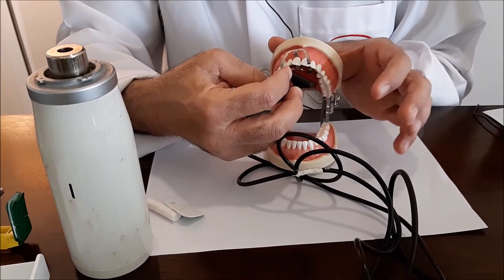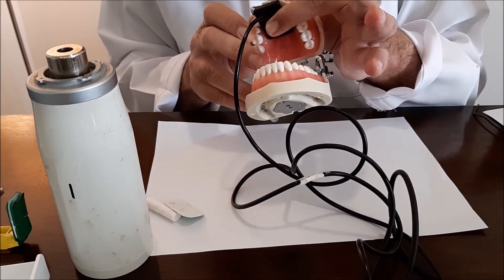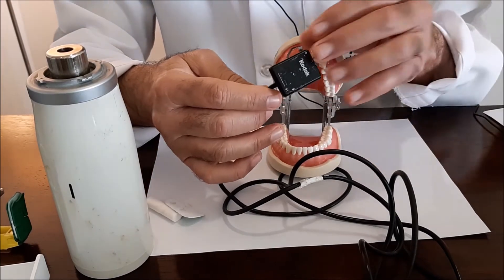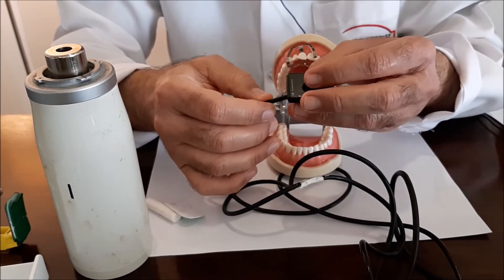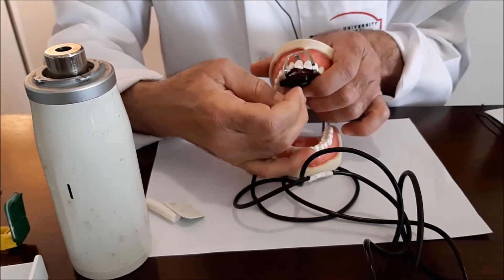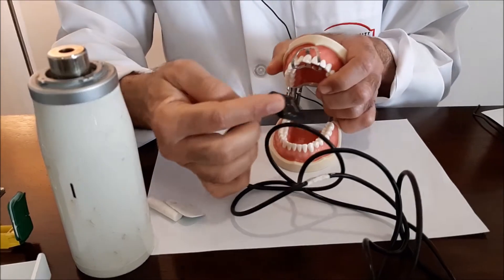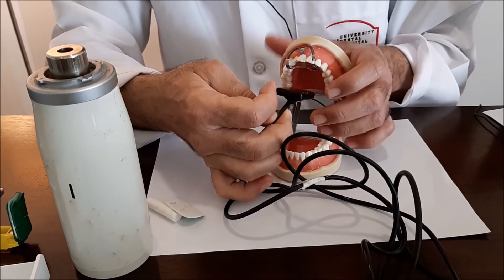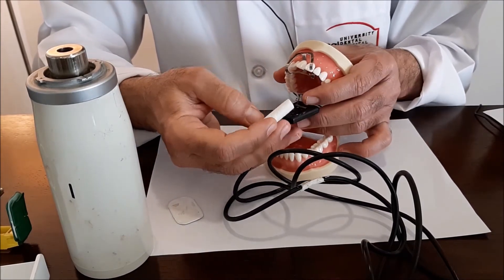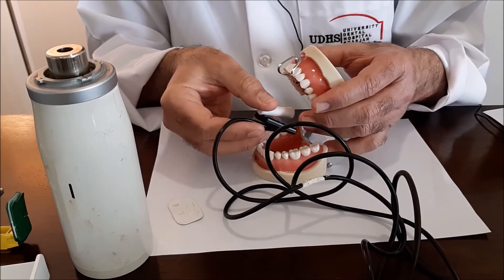Then you instruct your patient to hold or support the sensor from inside. Now here is the tricky part: inside the oral cavity you are going to put a sleeve on the sensor as an infection control barrier, and this tends to make the sensor more slippery. During placement, it slides off the tooth with the presence of the clamp, saliva, and this slippery cover. So I would advise placing a cotton roll in between the exposure side of the sensor and the palatal surface of the tooth.